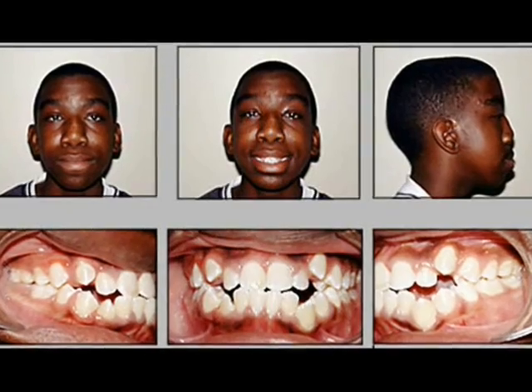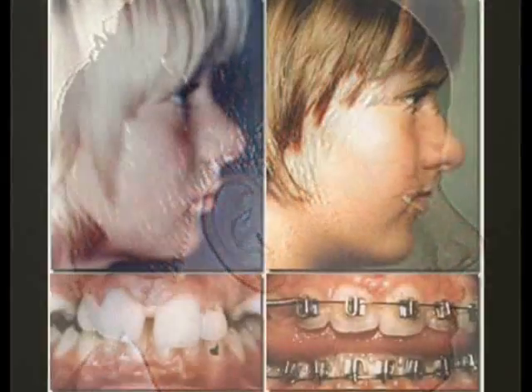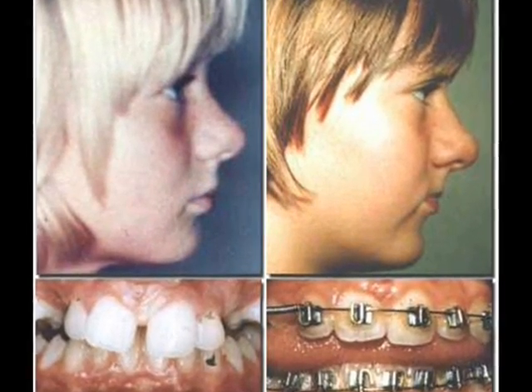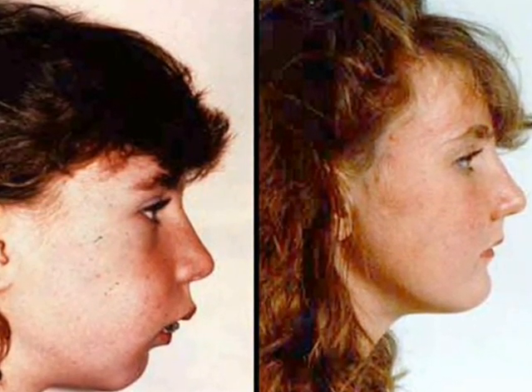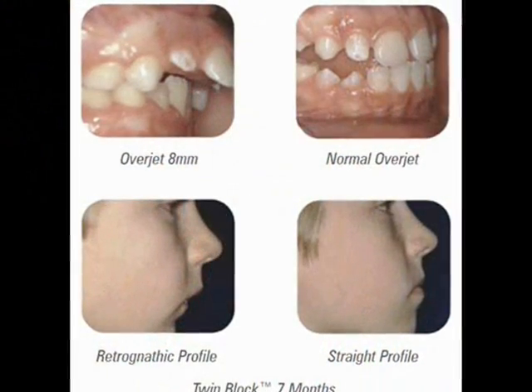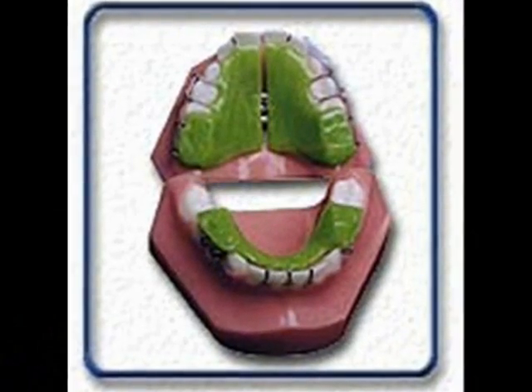Most children with crowded teeth and bad bites have narrow and underdeveloped lower jaws, which could be corrected with functional appliances. Functional appliances help correct the bone problem, while the teeth problem is corrected with orthodontic braces. The ideal age to use it is between 7 to 11 years, when the cooperation level is highest. However, it can also be used at an age of 4 years if the upper jaw is too narrow, causing breathing and speech problems. In case of adults, it is used to develop the arch to a more normal shape and size before applying braces.